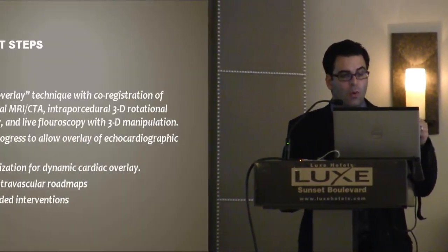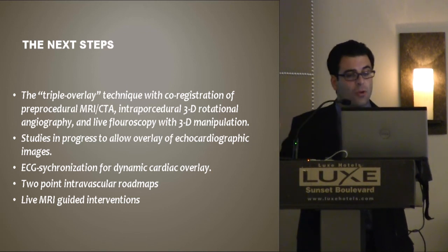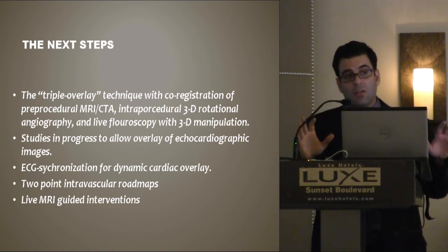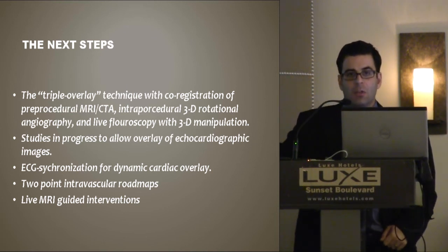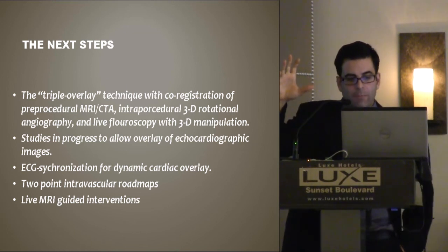So what are the next steps? Triple overlay technique with co-registration of pre-procedural MRI CT, intra-procedural 3D rotational angiography, and then live fluoroscopy, all with 3D manipulation. And then there are studies in progress to even add 3D echo to that, so that you can have a live echocardiographic image that you can switch back and forth to that's overlaid on your fluoroscopy screen.